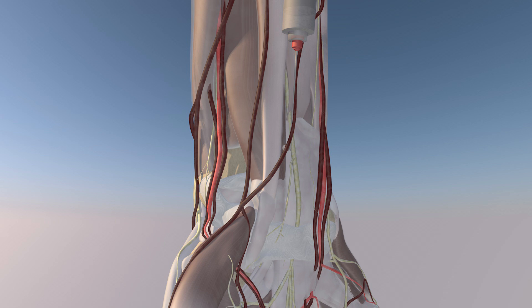Here is the procedure again in slow motion. You can see the injectate going above and around the median nerve.